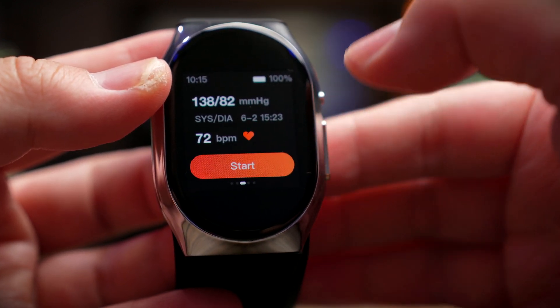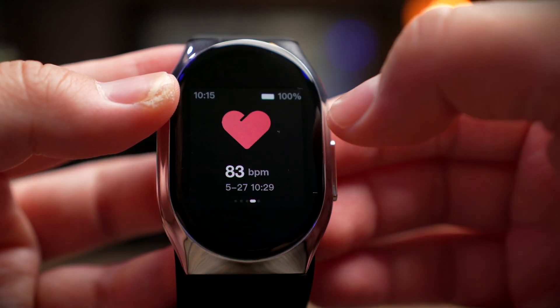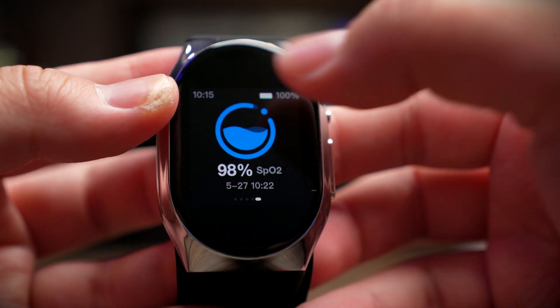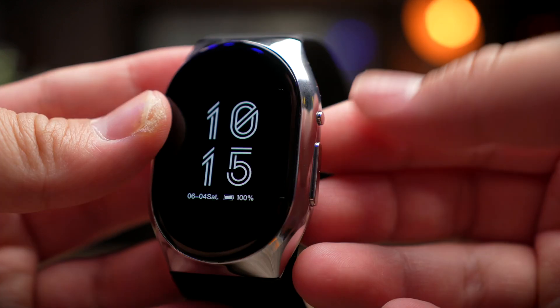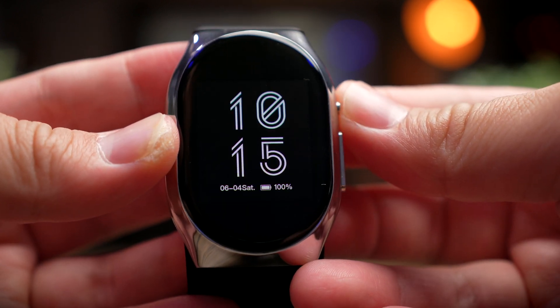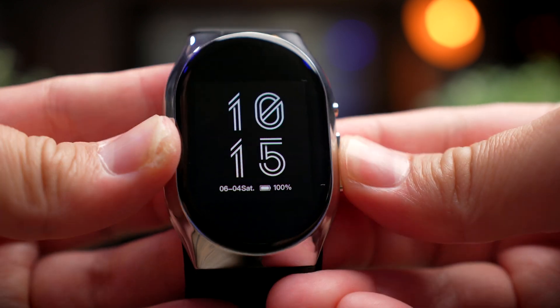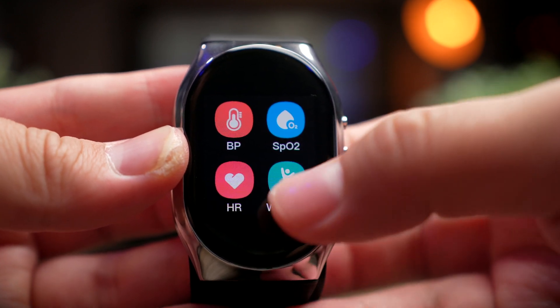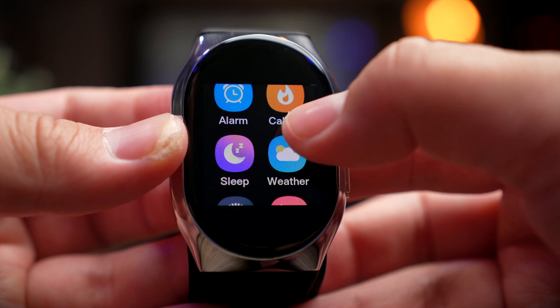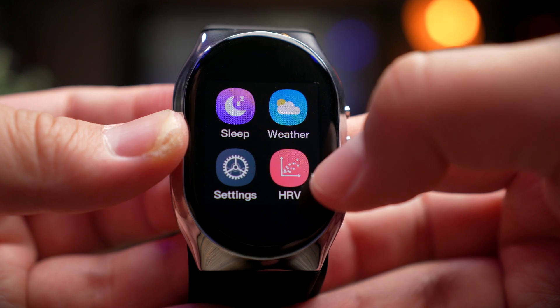Swiping from the right brings you to your widgets: first is BP monitoring, then heart rate monitoring, then SPO2 monitoring — and that's it. The top side button sleeps or wakes the watch, and the larger bottom button opens the menu, where you'll find workouts, alarms, weather, and HRV (heart rate variability) monitoring. The overall UI works really well and functions pretty smoothly.